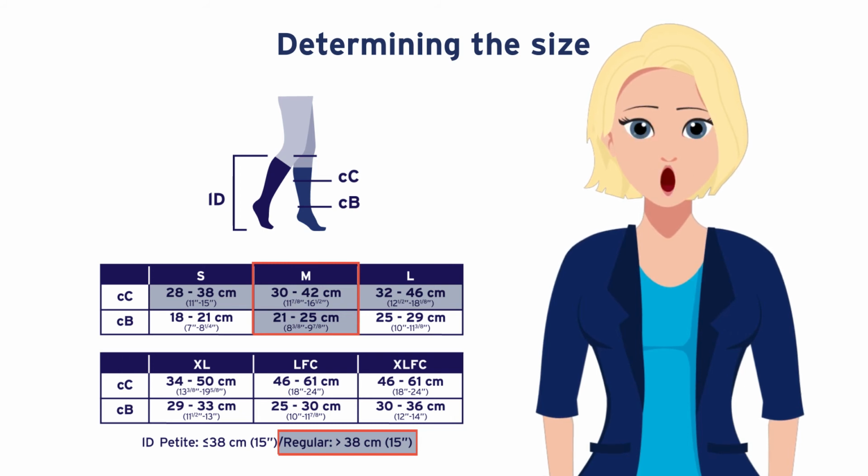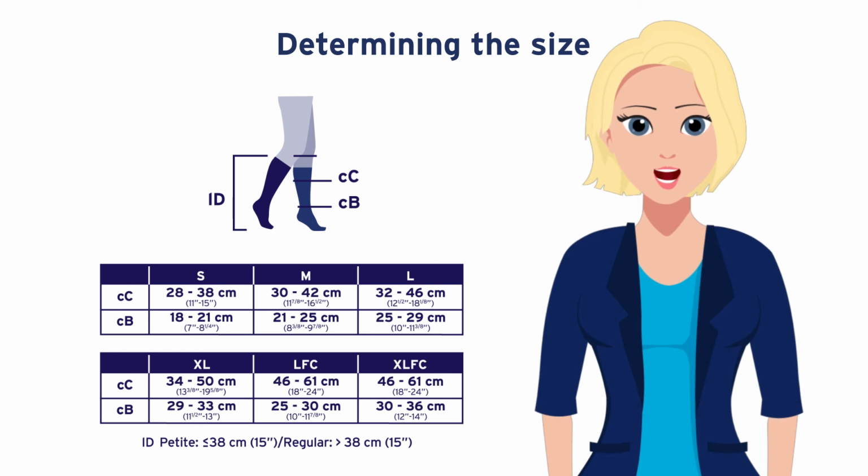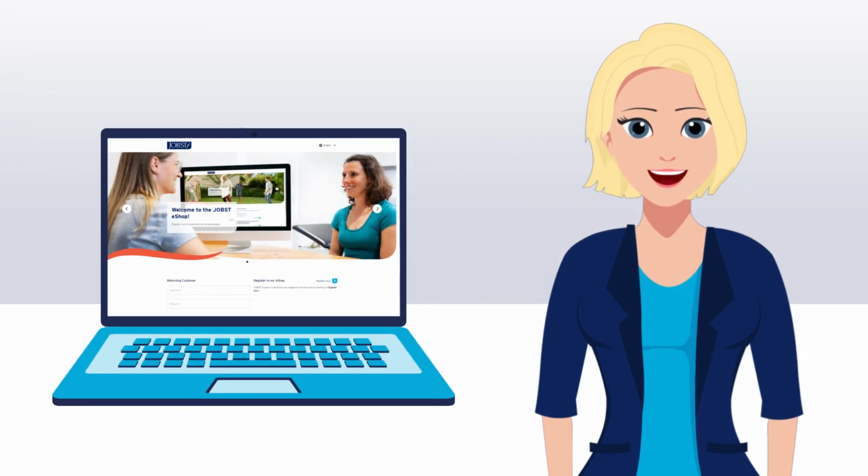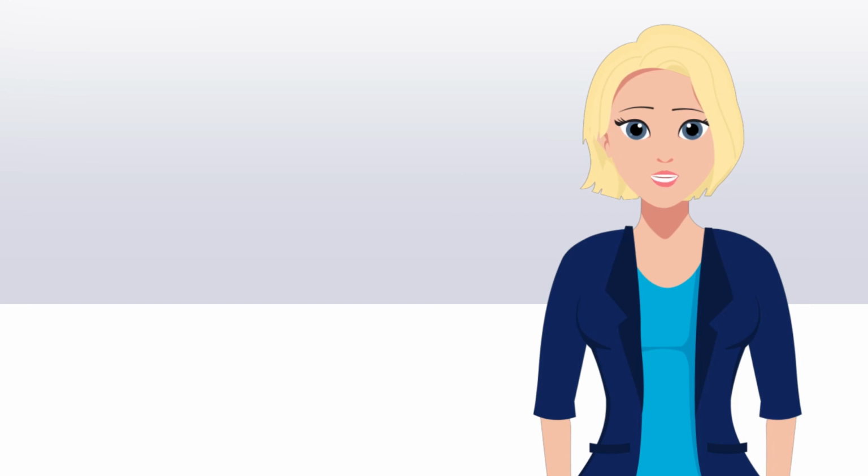If the measurements do not fit into one size, we recommend reaching out to a healthcare professional for a made-to-measure garment. To order the garment in case you're a patient, please look for the closest JOBST distributor in your area. To order the garment in case you're a healthcare professional, please go to the JOBST e-shop or follow the instructions on the order form.